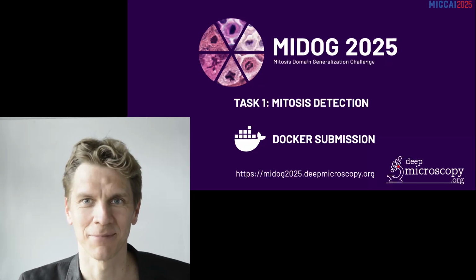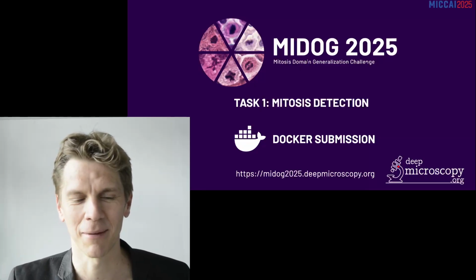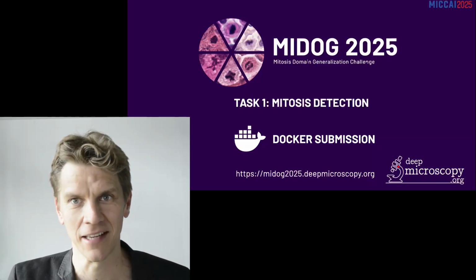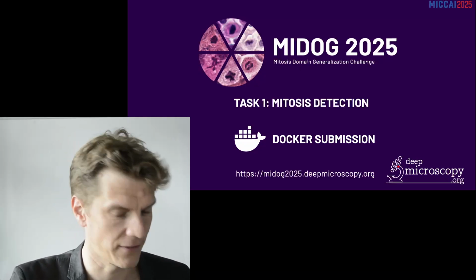Hi and welcome back. So this time I'm going to do another video for you. It will be about the Docker submission process in track number 1 of the MIDOG 2025 challenge. Okay, let's get this started.